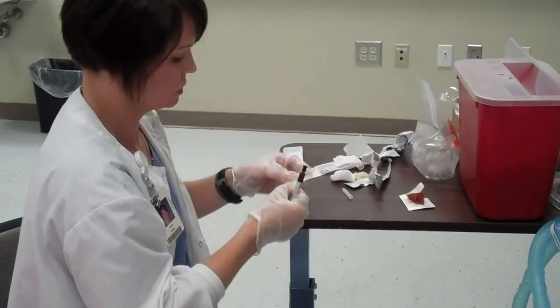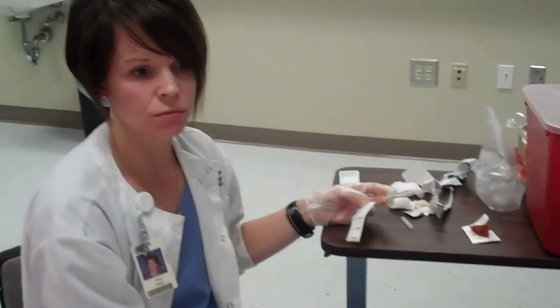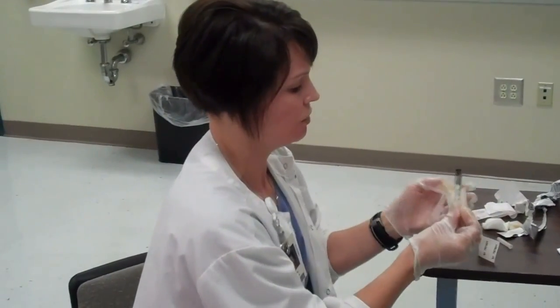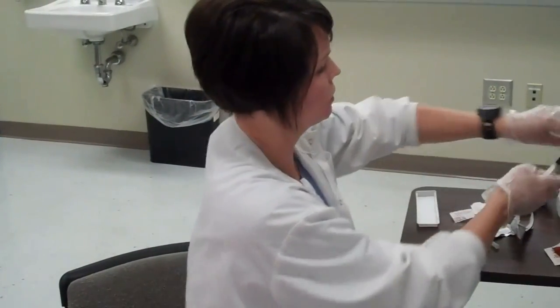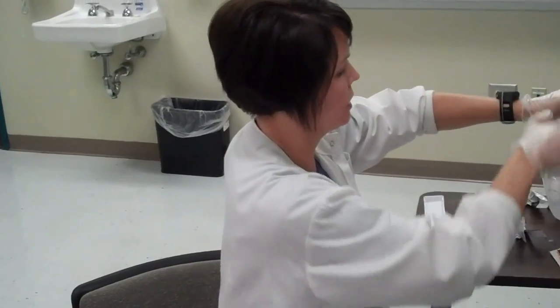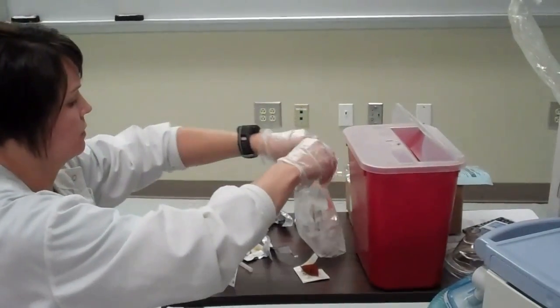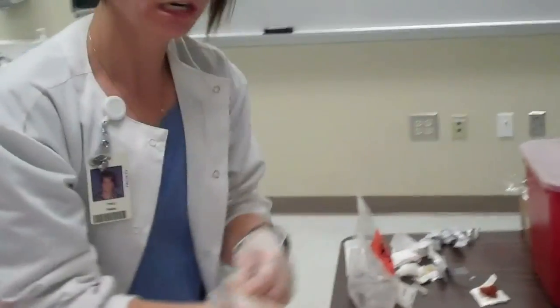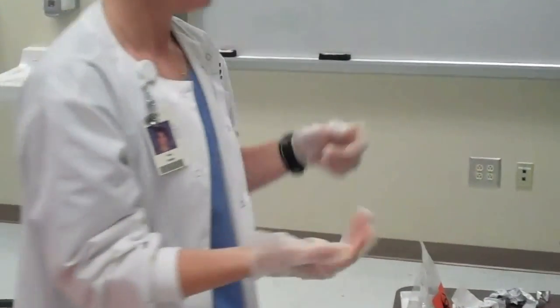We have to label. I'll write down exactly what the patient was on — two liters nasal cannula — and their name. In most facilities now you can get stickers that have all of that information. You want to take those, wrap it over the back, and put it in your bag. Close it up. Clean up your mess. There it is.